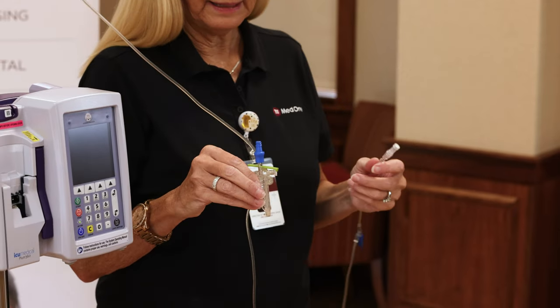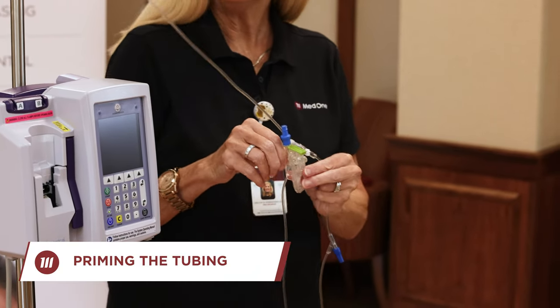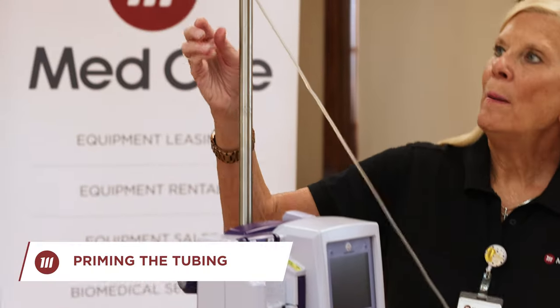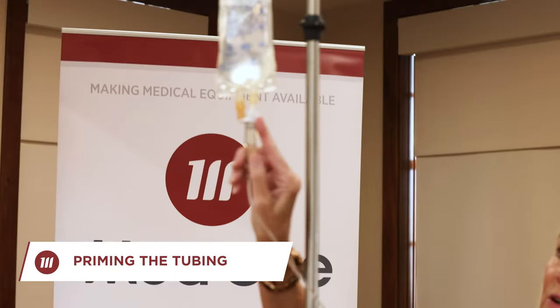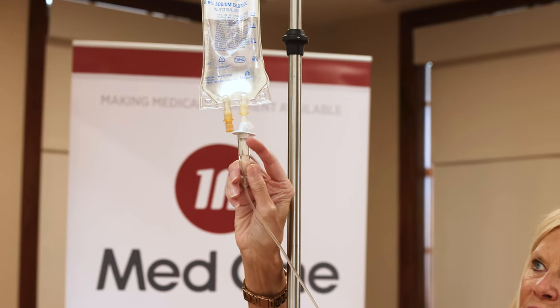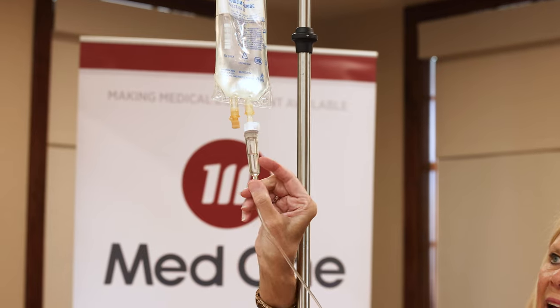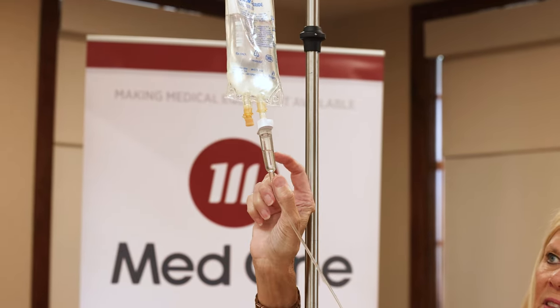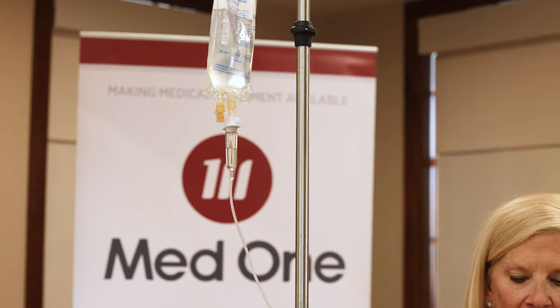I have already primed this tubing but I'll review that for you. Up at the top of the spike there's a vent — if you have rigid or glass bottle deliveries, you would open that to vent. There is a little line on the drip chamber; you will want to fill your fluid up to that line.